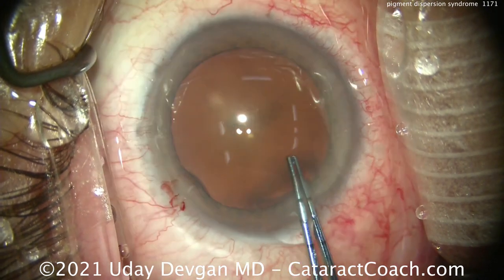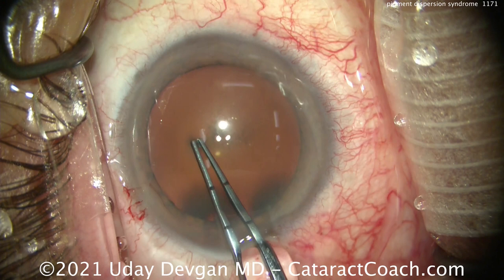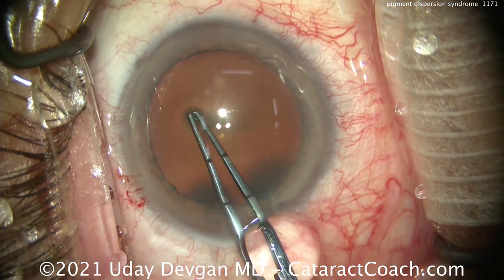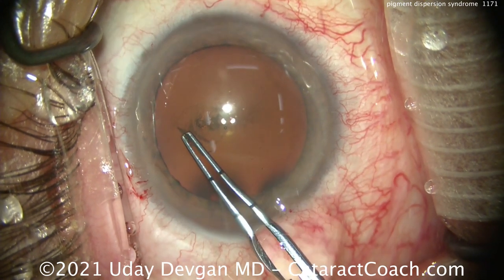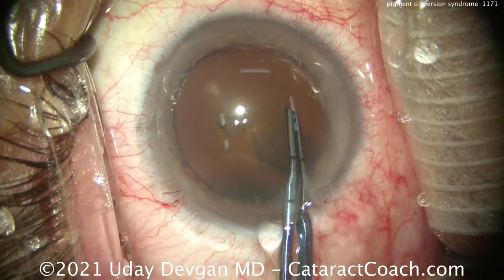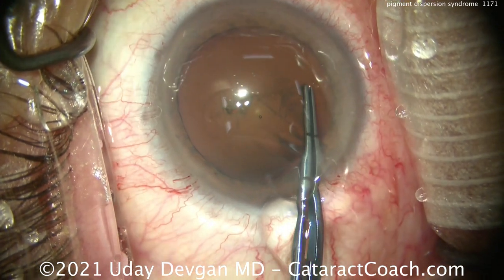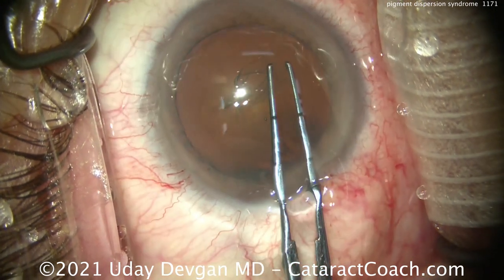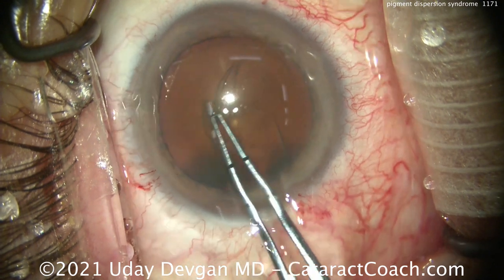Pigment dispersion syndrome involves a loss of some iris pigment that goes throughout the anterior segment of the eye. It can actually block off part of the trabecular meshwork, decreasing the outflow of the eye. In some patients, pigment dispersion syndrome can be associated with a glaucomatous situation, so these patients should be watched carefully.